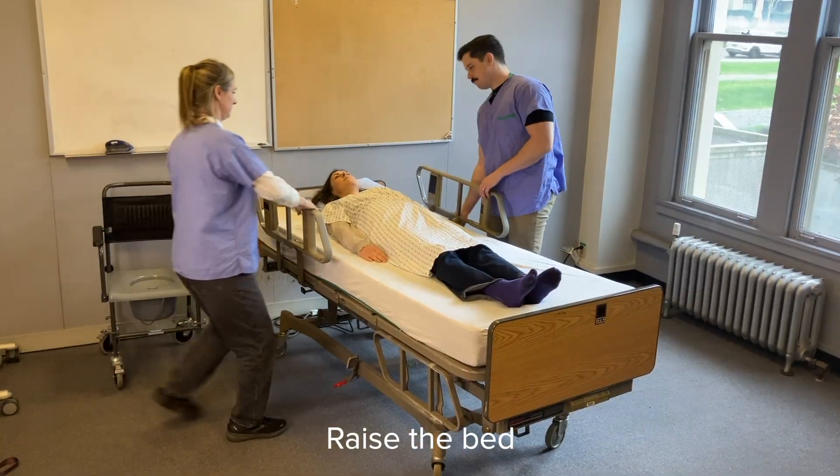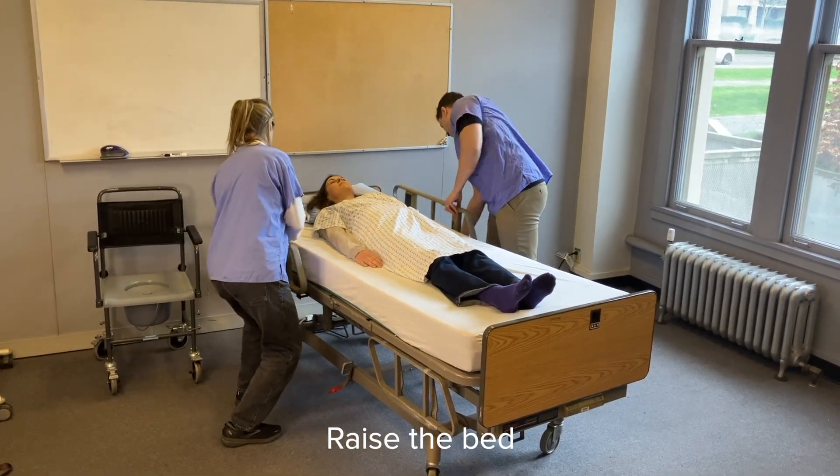Raise the bed to a good working height. This is between the hip and waist of the shortest caregiver.